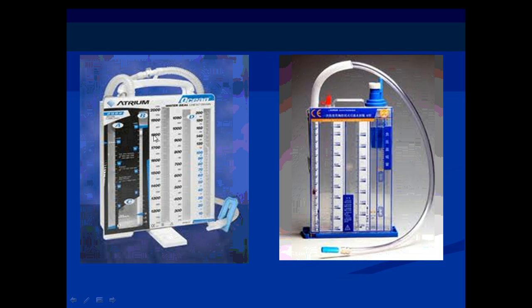We can connect it to a suction if we want to put the chest tube on suction with a certain pressure or a certain negative suction. We can calculate here the amount of suction that we would like to connect the patient to. Then we connect this tube to the outside sucker, to allow more drainage of effusion or drainage of pneumothorax if there is an air leak.